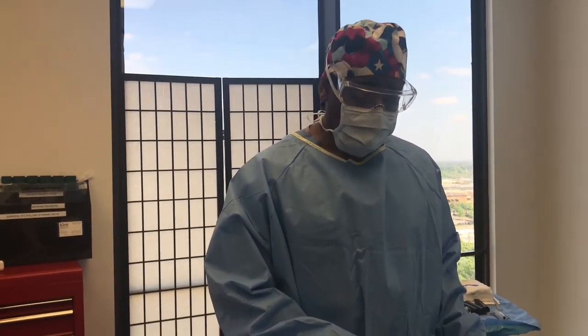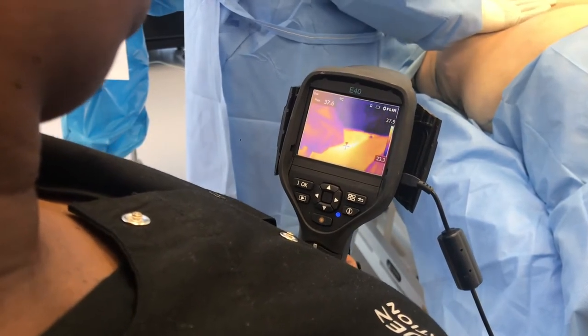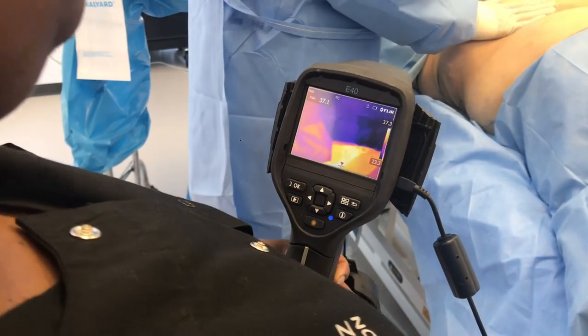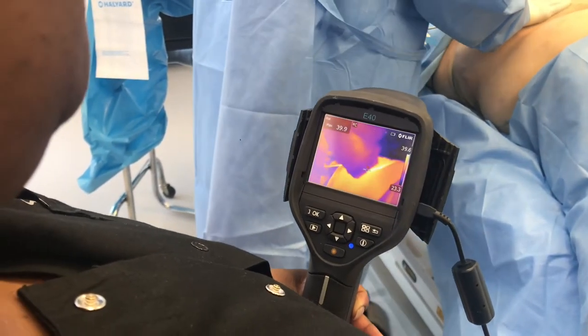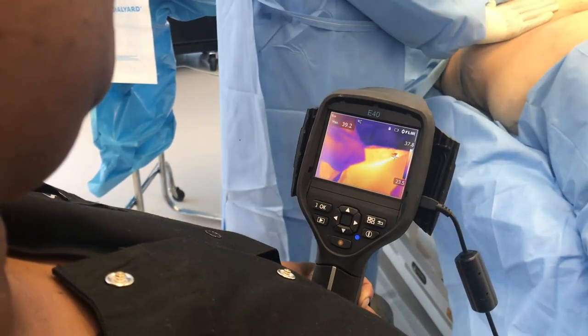Many times the skin will be much flatter and tighter — not as tight as a tummy tuck, but much more satisfactory to the patient without having to go through a major operation, major expense, and major recovery time. I'm heating up this quadrant in the lower part of the tummy, which is the part that would normally be cut away with a tummy tuck, because we don't want the skin to be hanging really loose after we've deflated it by taking out all the fat. This is also an area where you have more stretch marks because the skin has been stretched a lot.